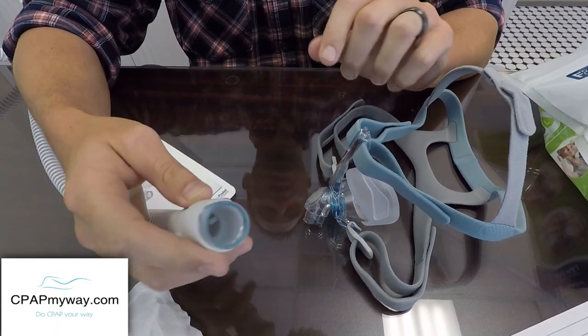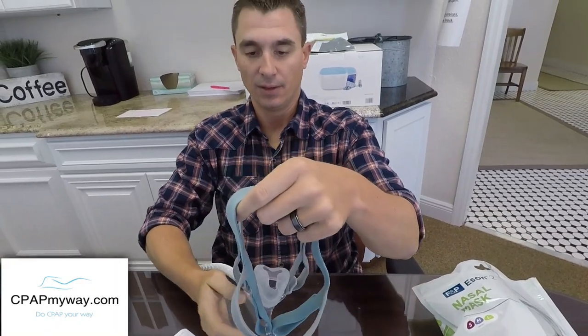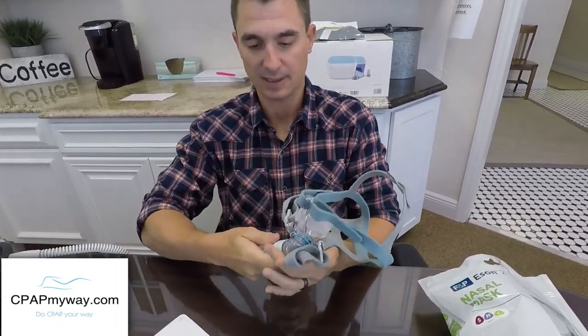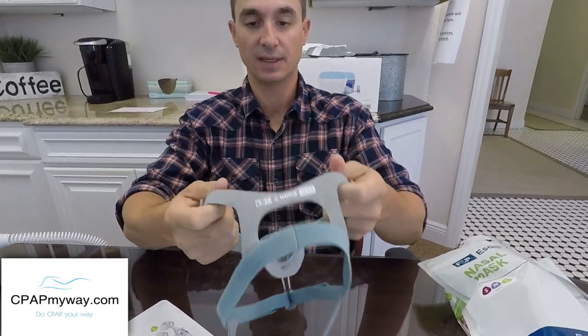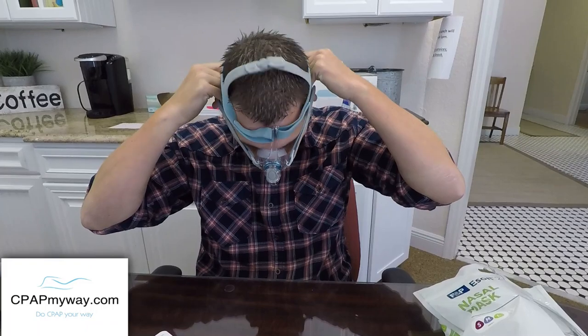So let's try it on, get a little feel for how it sounds. One thing that's interesting about the way they recommend fitting this particular mask, here, I'm gonna take it loose, is that it's a stretch fit headgear, so you're supposed to be able to just grab the bottom straps, slip your nose in, and pull it over. Get a little hair gel flying everywhere. And it fits like this. I mean, obviously you saw me put it on and it looks pretty stable, it all is good.